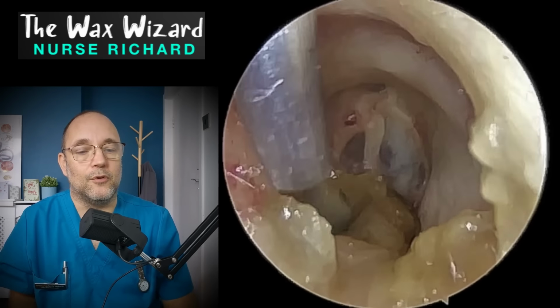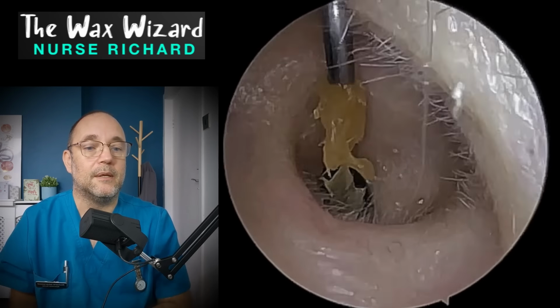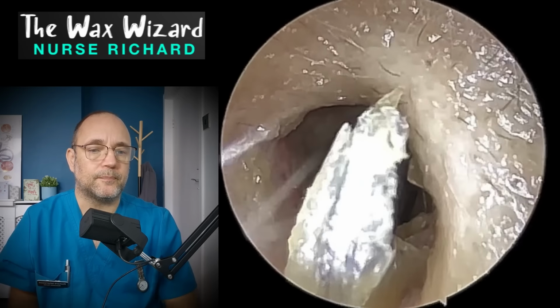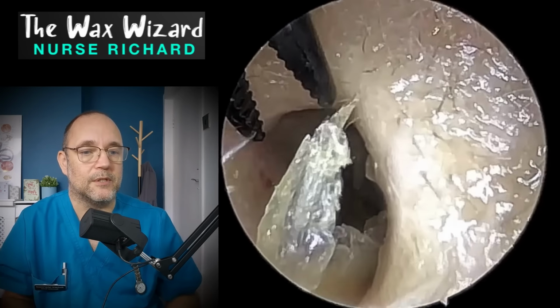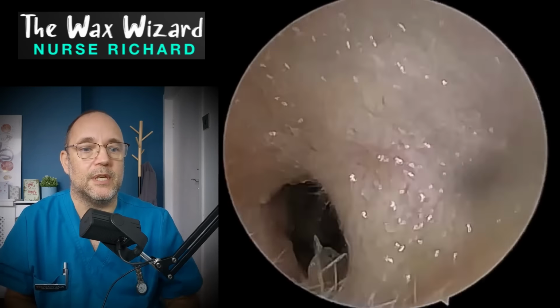So I don't think we'll ever 100% know what the actual cause of that is, whether it's caused from a problem with the blood supply to the base of the ear canal, or whether it's caused by the plug burying down into it, so from the top or the bottom. It's very hard to know. Anyway, this was her other ear, and you see what I mean when I say it was a bit bumpy as well. So it could have been just that the plug was sitting in one of these little crevices and it's just had a bit of a nibble away at it. That's possible too.